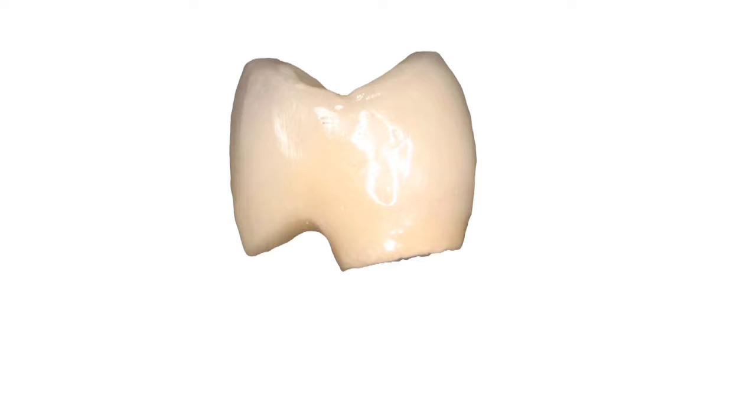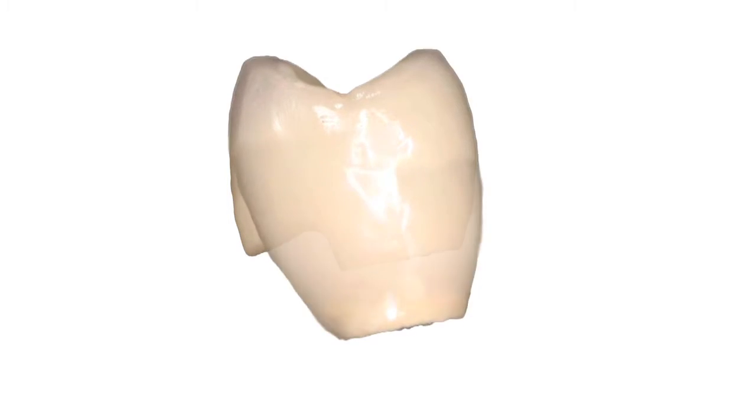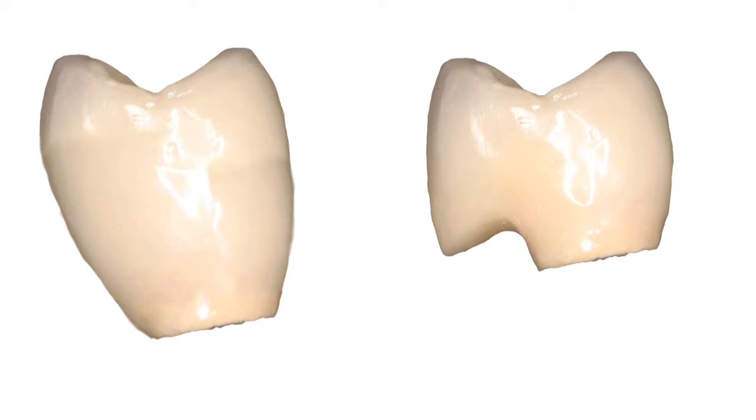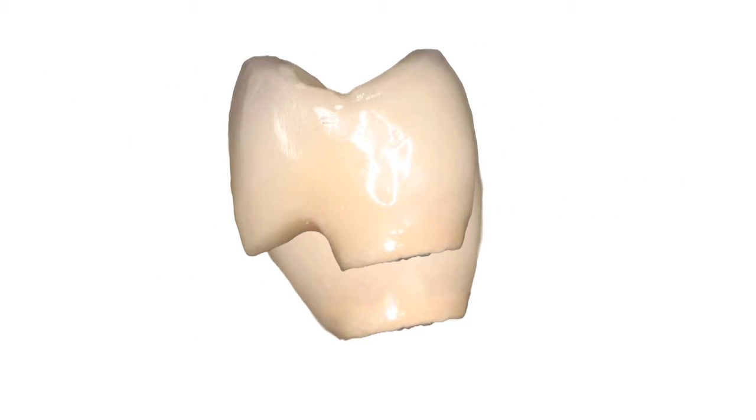The problem we're having in this case was the implant wasn't placed deep enough, and was so high that they had to then jump over the tissue and make it look like it was actually coming out of the tissue, a different area now. And now this tissue constantly has an issue underneath there where you can't get in there and clean very easily, and that becomes a problem. What it should have looked like is this. They should have extended it a little further down, then they could have had a contoured implant abutment or crown that came out of the tissue in much better position. Again, just being aware that oftentimes the position needs to be a little deeper than you expect sometimes.